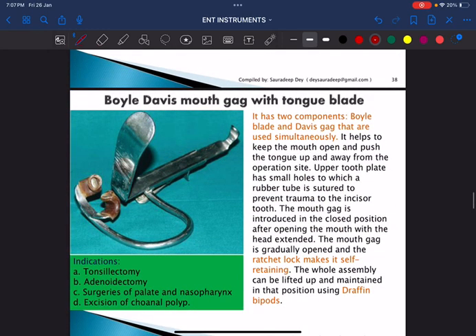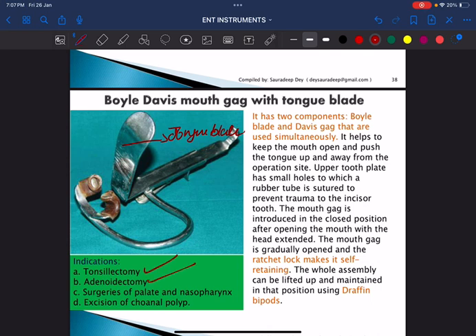This is the Boyle-Davis mouth gag with tongue blade. Unlike Doyen's mouth gag, it has a tongue blade. It is used for tonsillectomy, adenoidectomy, excision of choanal polyps, and surgery on the palate and nasopharynx. It has two components — Boyle's blade and Davis gag — used simultaneously, with a lock that makes it self-retaining.